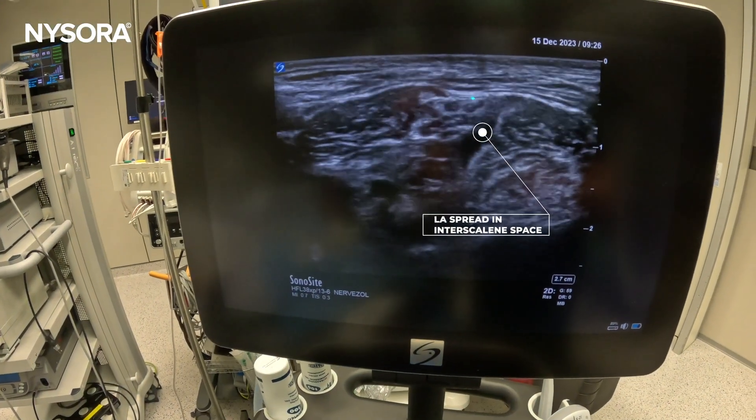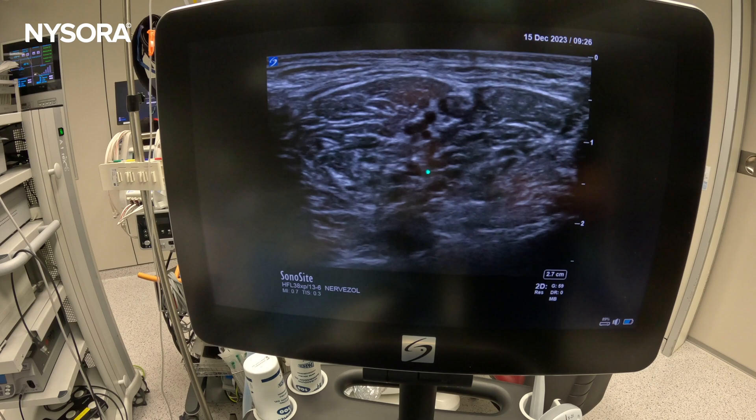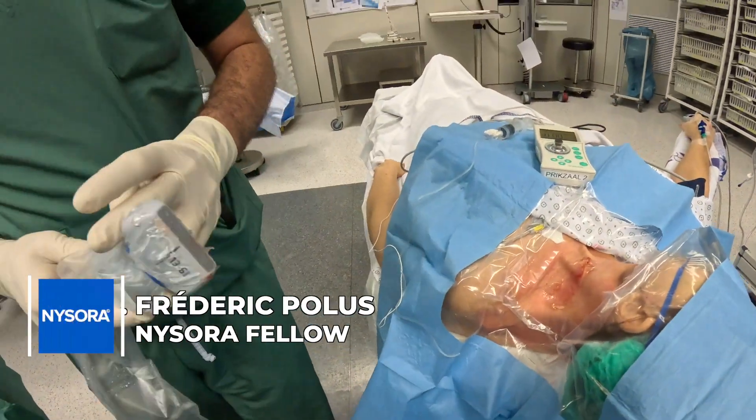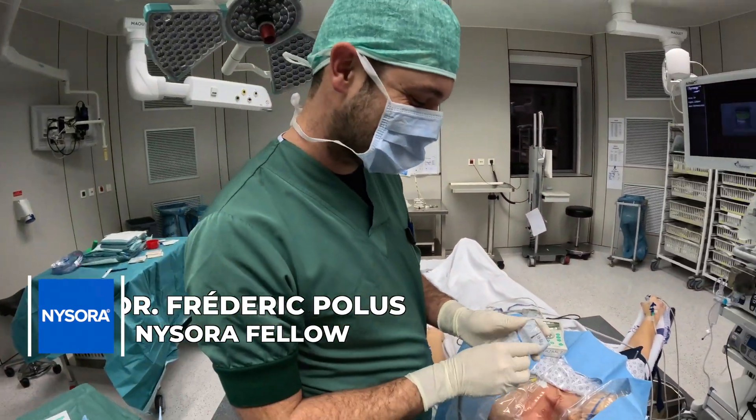So you enter like this, you got a twitch, and the local anesthetic — it's only five CCs. Look at the spread. Nice. Fellows need to learn, huh?